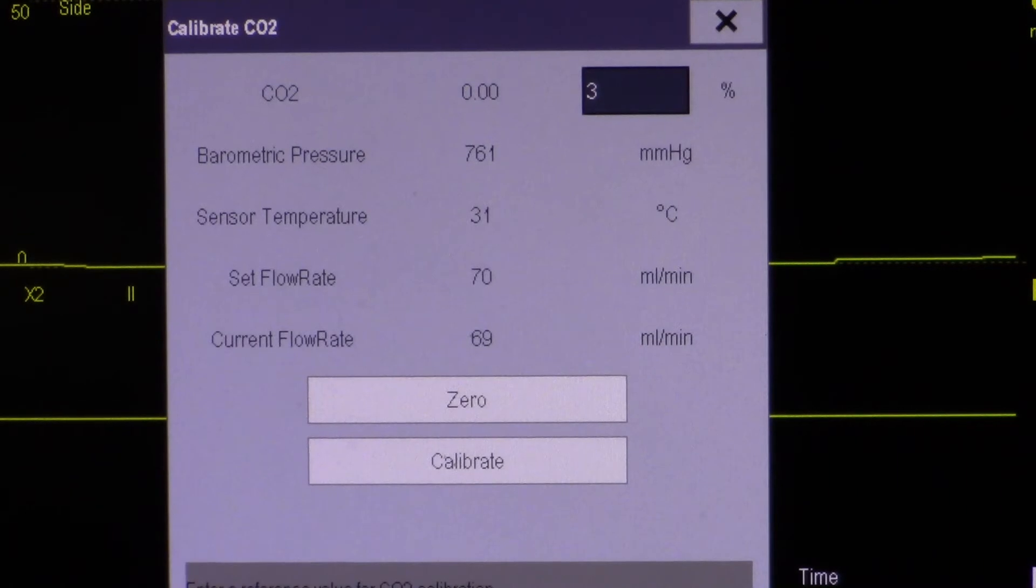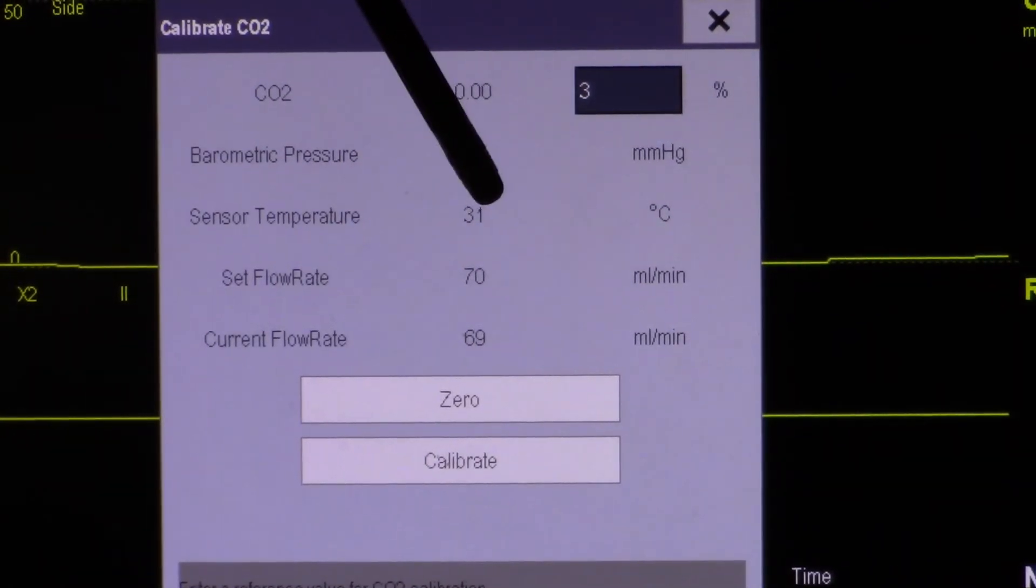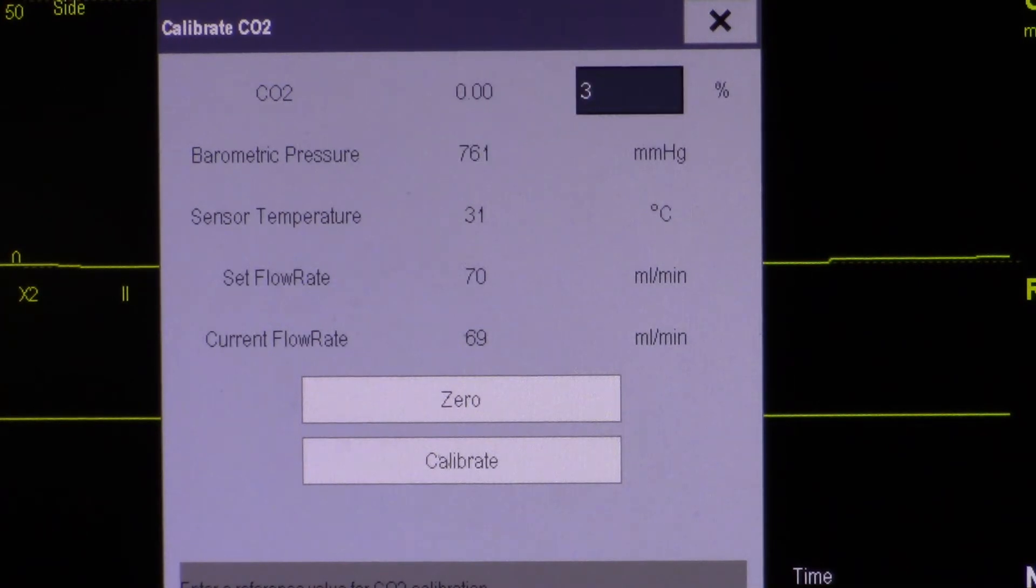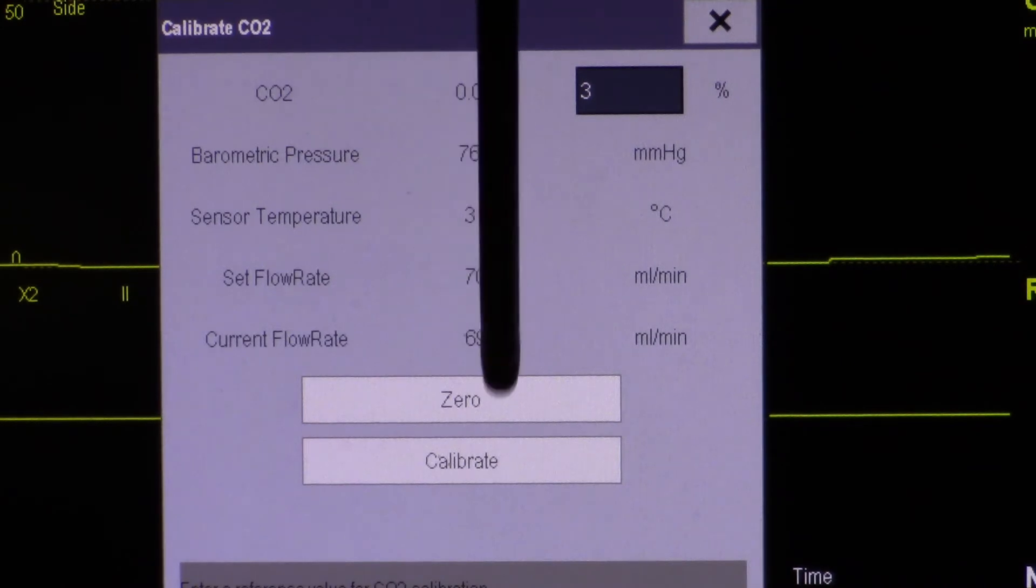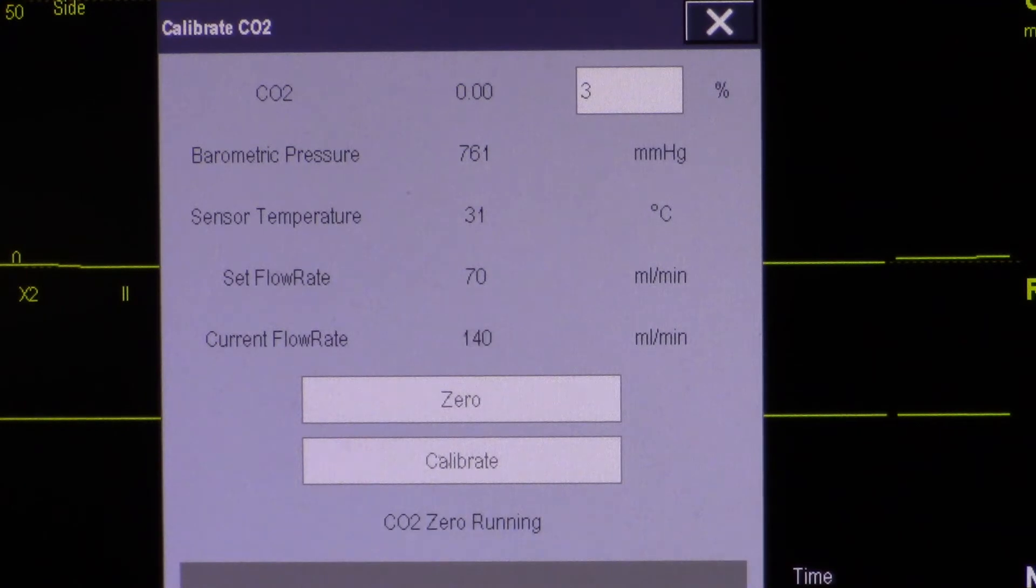Verify your sensor temperature is at or better than 30 degrees Celsius. Once verified, select zero. Allow the CO2 module to zero.